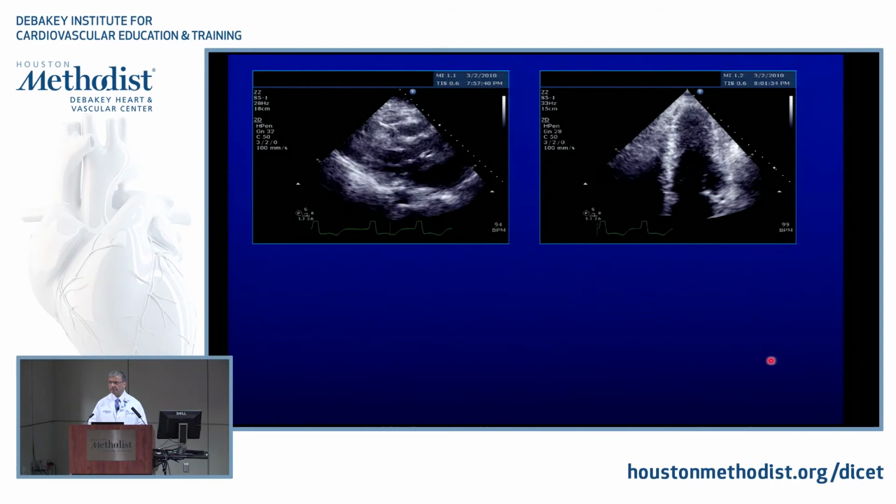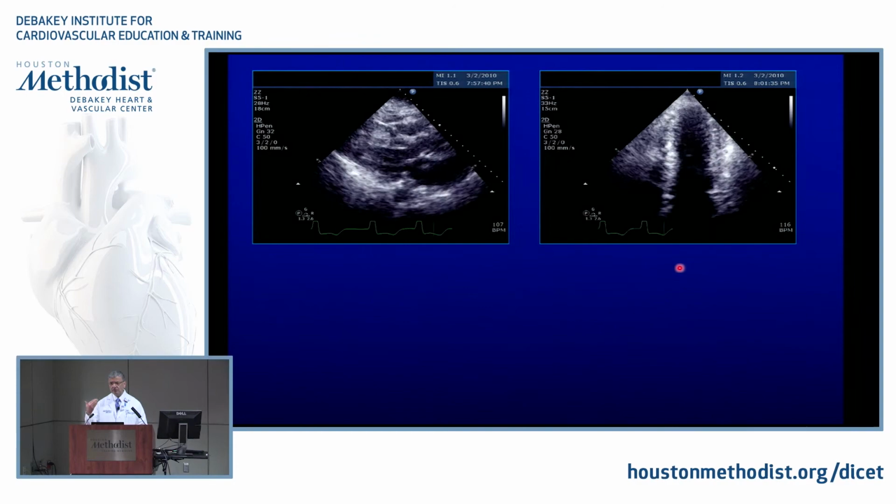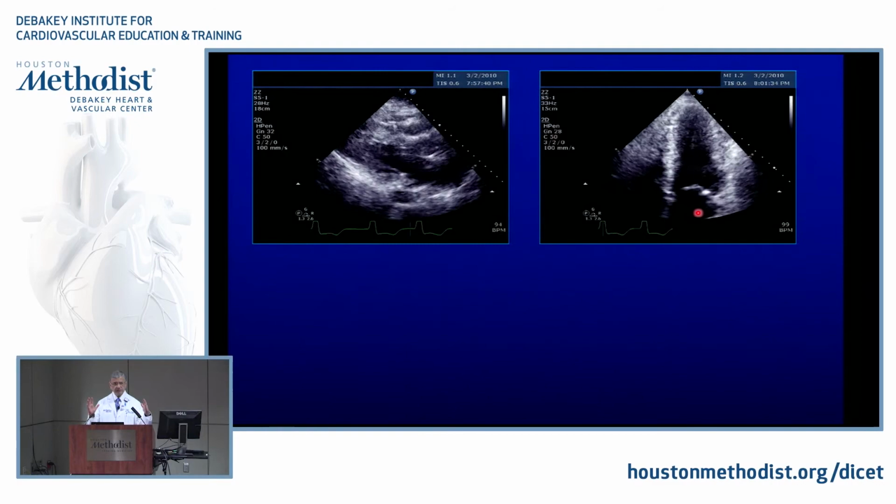Can't hear you. You don't see the full diastole. Yes, you do. I mean, you have a cycle and a half for you. What's unusual? I can tell you what's unusual, and this should always be with you. What's unusual is when the heart contracts normally, there is not only endocardial motion, but there is epicardial motion inward. So there is some contraction of the total body of the heart from the outside. And you see that here, and you don't see this here.